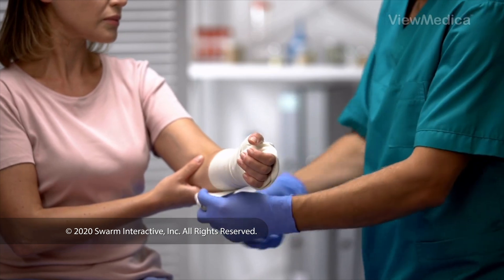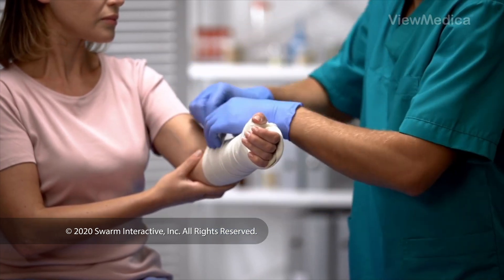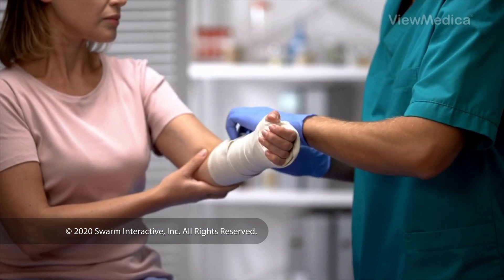When the surgery is done, your wrist and hand may be placed in a splint. You're monitored for a brief time before going home. Follow your surgeon's instructions for a safe recovery.